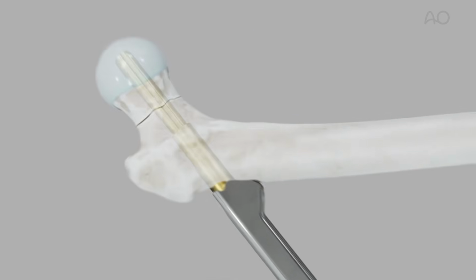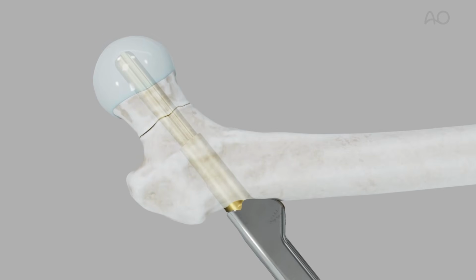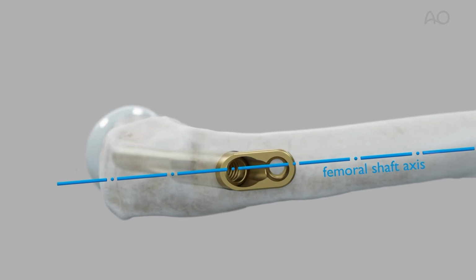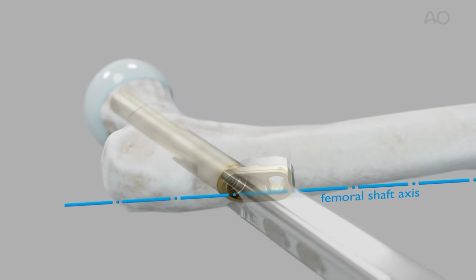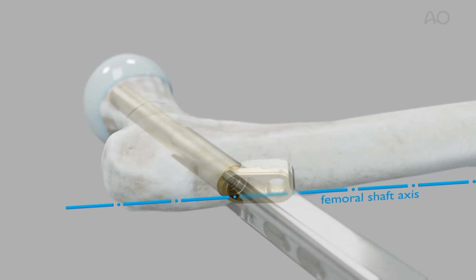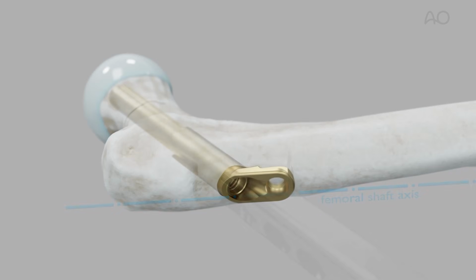Shown is the plate positioning. Observe that the plate is inserted down to the bone and aligned to the axis of the femoral shaft. Note that it is possible to perform a secondary adjustment in order to align the plate to the femoral shaft by rotating the insertion handle.